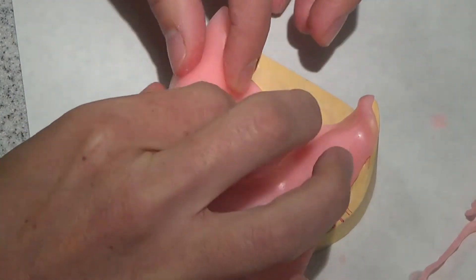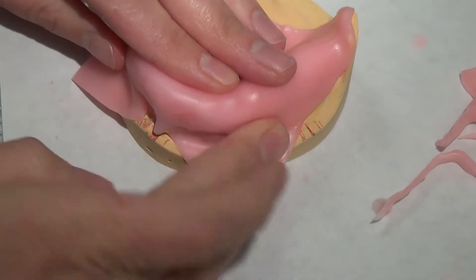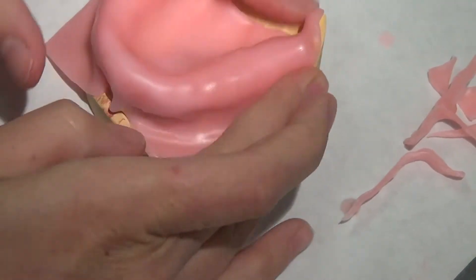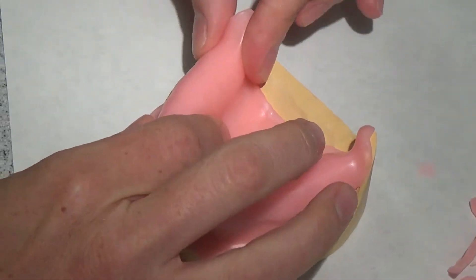And I want to keep it there. I usually tend to really adapt my wax at the land area. That's where I put the most pressure, because then I have a visual of where I'm cutting back to, kind of can know how high up to come.